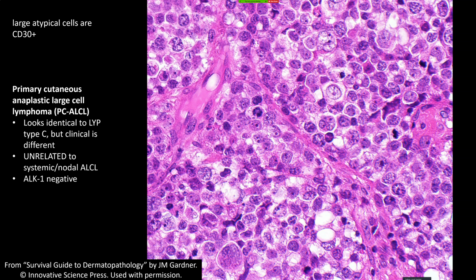And ALK is positive in a variety of other things. In the skin, not very many things. Some of the things that you can see ALK in, if you're making a list to remember: epithelioid fibrous histiocytomas are ALK positive. Some spitzoid lesions are ALK positive, like Spitz nevus and sometimes Spitz melanoma. ALK is also positive sometimes in angiomatoid fibrous histiocytoma, which is a weird intermediate malignant potential tumor that is positive for ALK on immunohistochemistry, but is actually negative, I believe, for ALK fusions by molecular testing.